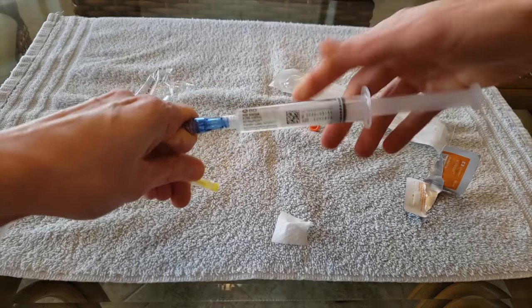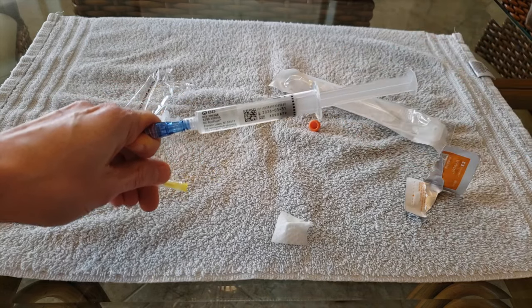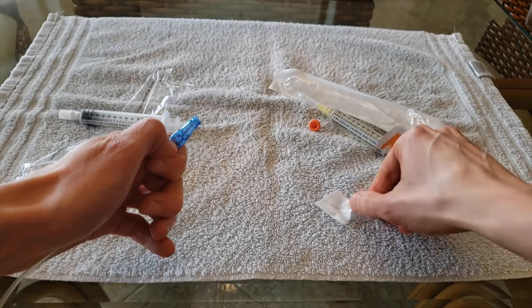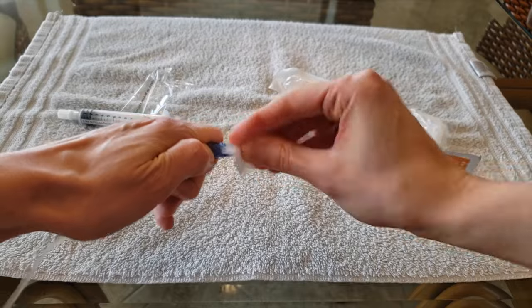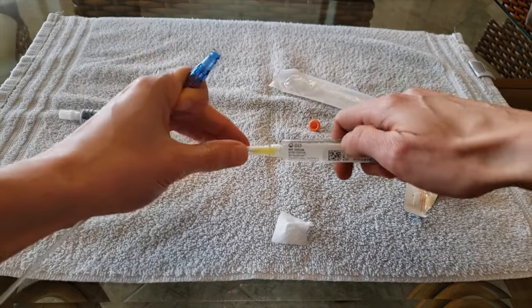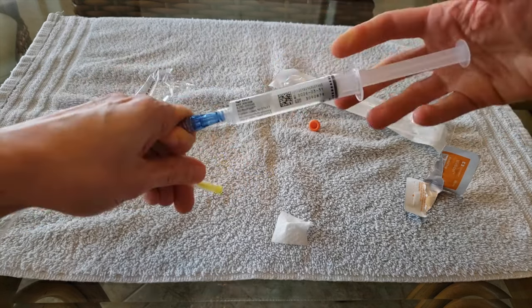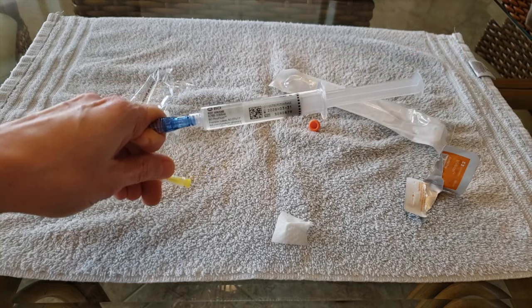I then begin infusing the antibiotic very slowly, over the course of about 30 minutes. When the first syringe with the antibiotic is finished, I disconnect the syringe. Next, I wipe off the end of the IV line with the alcohol wipe, disconnect the needle from the second antibiotic syringe, attach it to the IV line, and begin infusing the second syringe of antibiotic very slowly, again over the course of about 30 minutes.